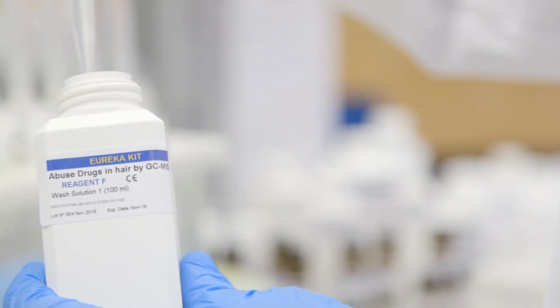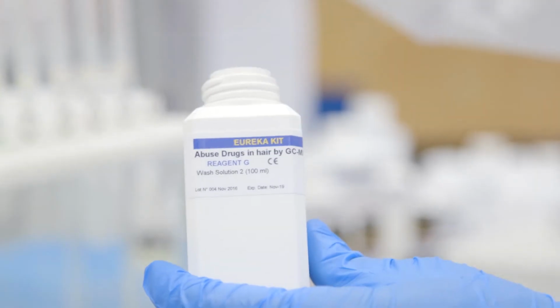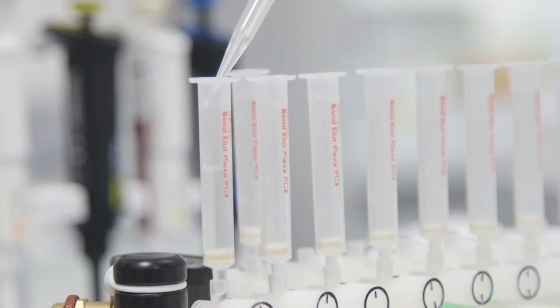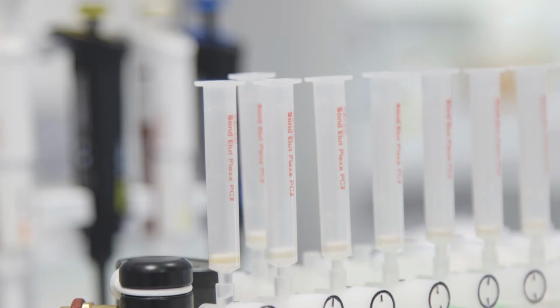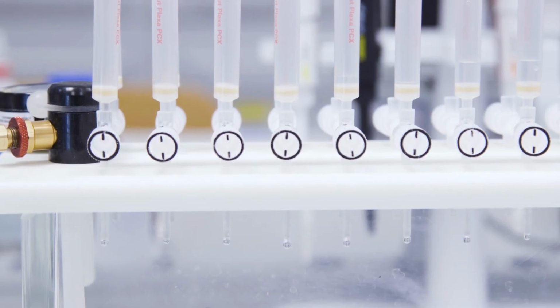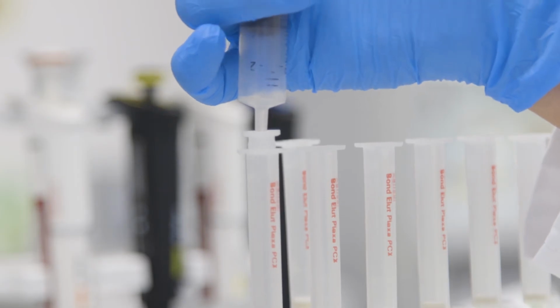First, we wash each column by adding 2 ml of reagent F, washing solution 1, and we discard the eluate. Then wash each column again, this time with 2 ml of reagent G, washing solution 2, and we discard the eluate. Finally, we wash each column for the third time, this time with 2 ml of reagent C, conditioning 1 and washing 3. In this case we pass all the liquid through the columns and discard the eluate. Unlike other washes, this time you dry the SPE column with a gentle airflow.